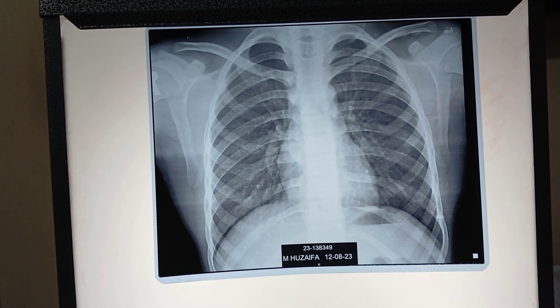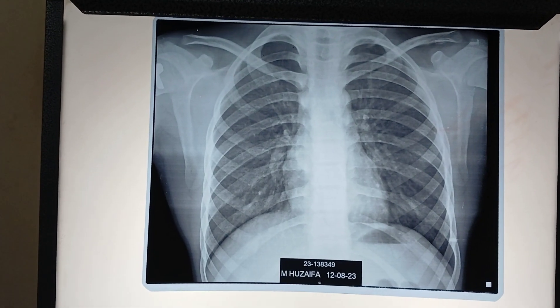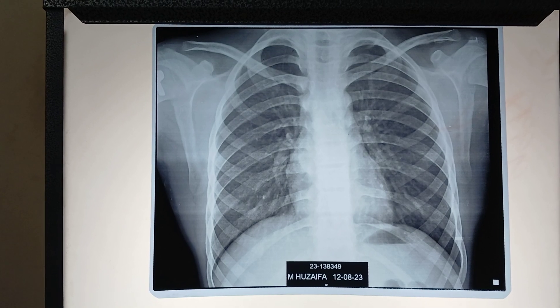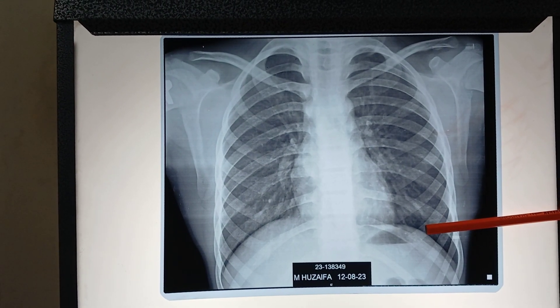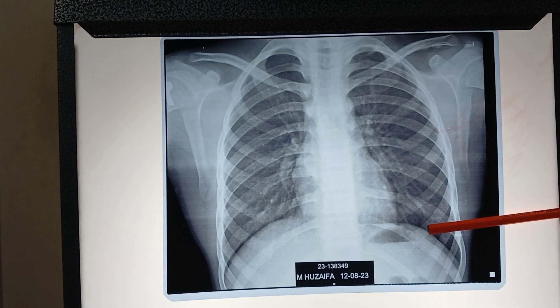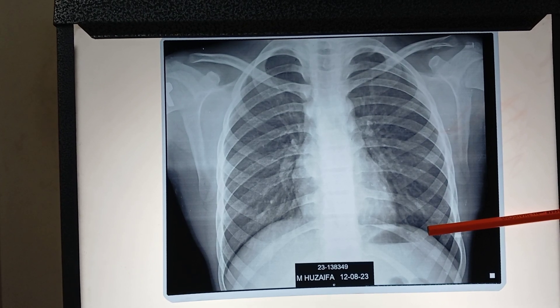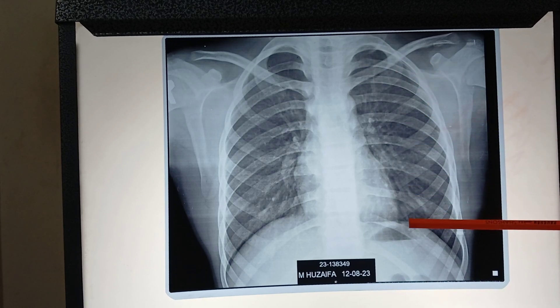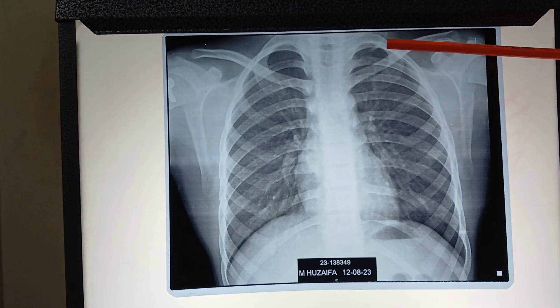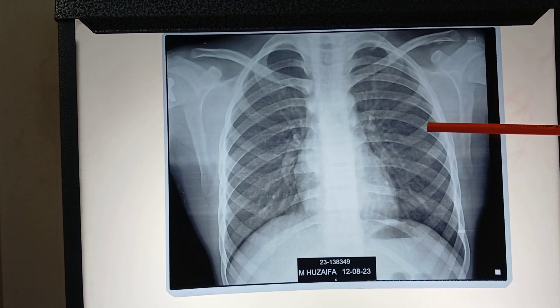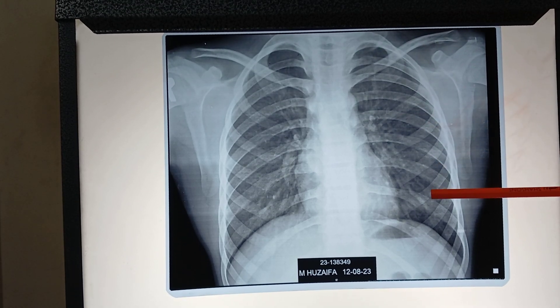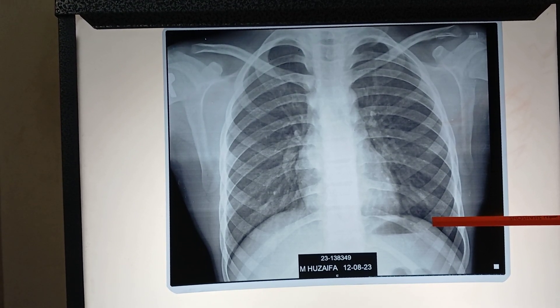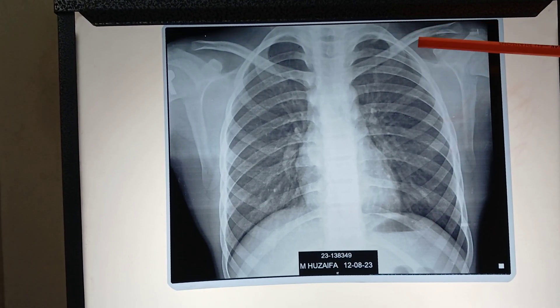The next point to assess the quality of the image is inspiration. A chest X-ray should be done in full inspiratory phase. The diaphragm should be intersected by 5-6 anterior ribs and 8-10 posterior ribs in the mid-clavicular line. These are the anterior ribs: 1st, 2nd, 3rd, 4th, 5th, and 6th. This 6th rib intersects the diaphragm in the mid-clavicular line.